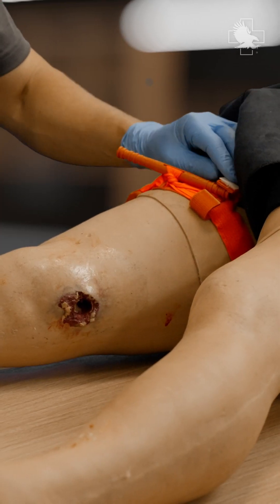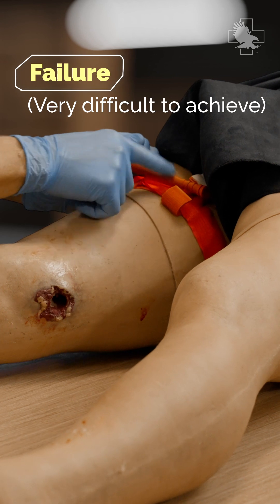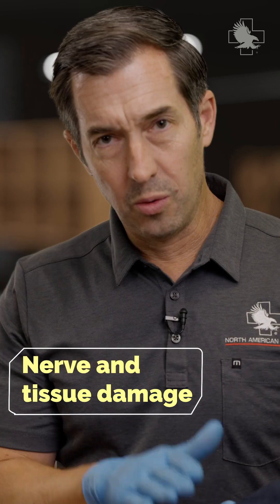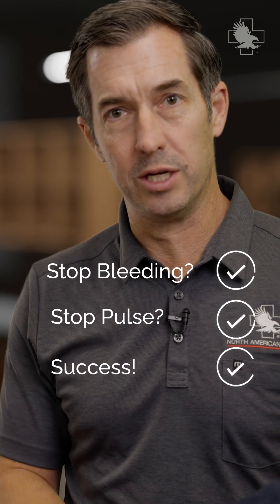So what happens if I keep going too tight? A couple things can happen. One is you can get a failure, which is really hard to do because this windlass is very strong. But number two is it can apply so much pressure that you really start doing damage to the nerve. What we want to do is go tight enough to stop bleeding, stop the pulse, and then stop there.